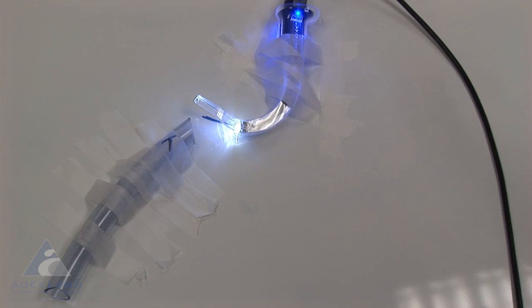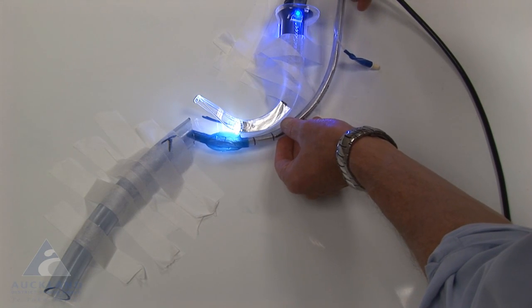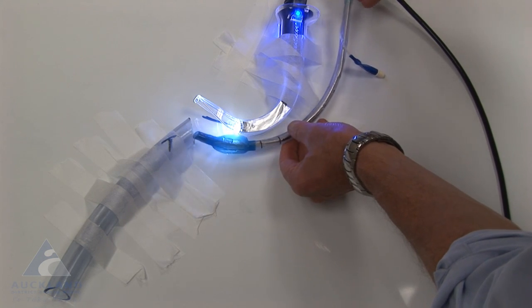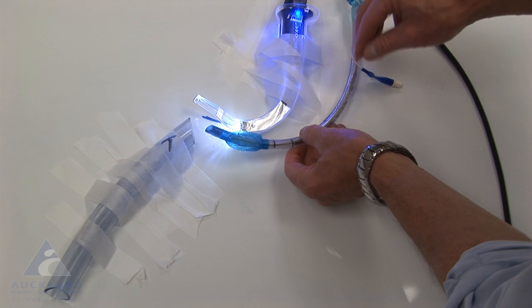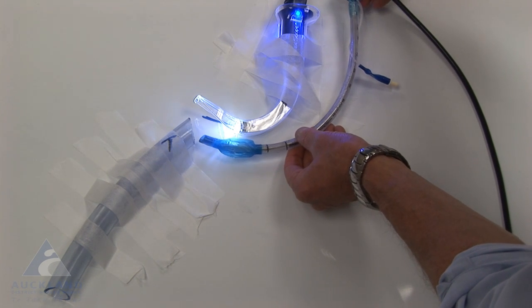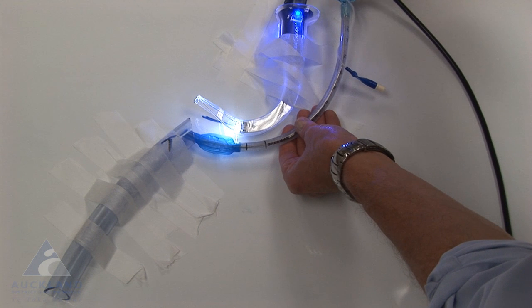The next image we are going to show is of an intubation with the mock-up that you've seen, and then we will show video of actual live intubations. I have mounted a 7.0 reinforced tube with a lubricated flexible tip on a stylet with further lubrication between the tube and the stylet itself. It comes around, it hits the anterior tracheal wall, and it does not want to move.